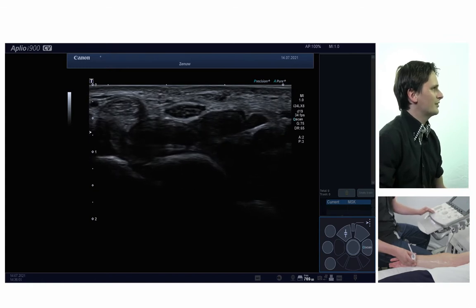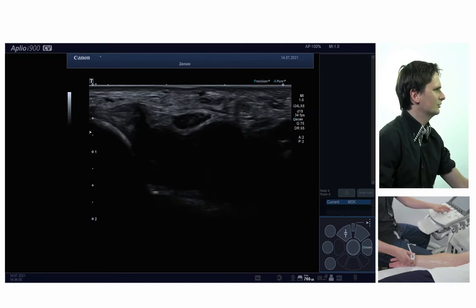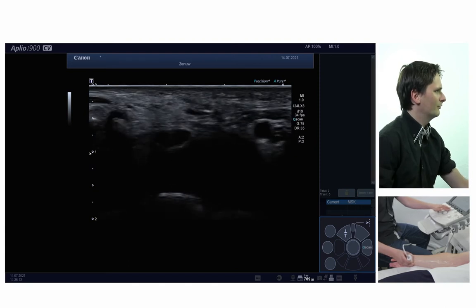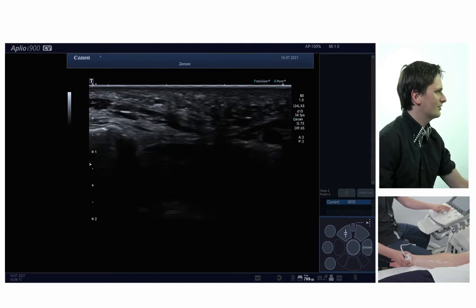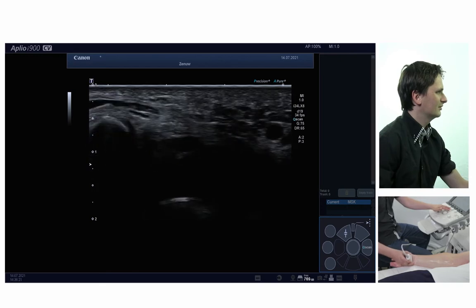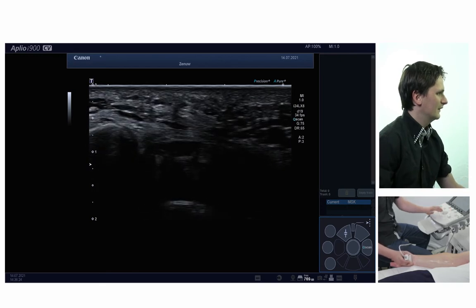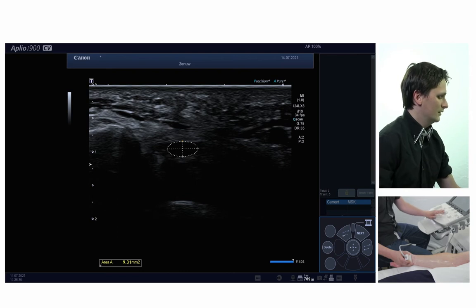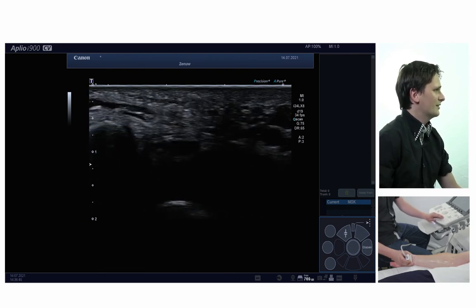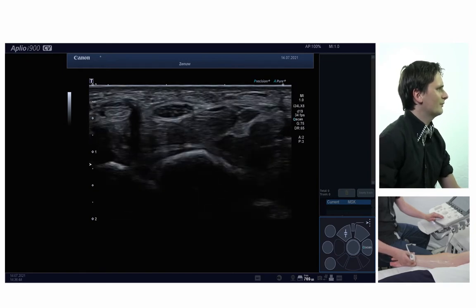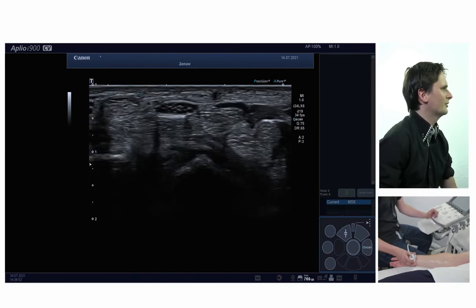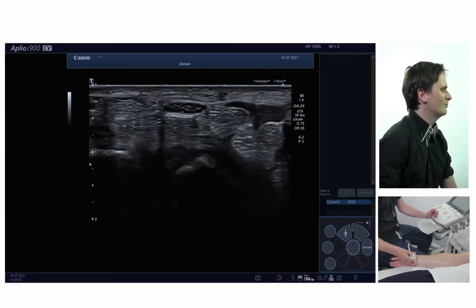Then I'll try to visualize the nerve more distally within the carpal tunnel. It can be a bit tricky sometimes because it will go deeper, so I will move my focus deeper as well and tilt my probe. Here you can see the nerve lying a bit deeper within the carpal tunnel — it's not enlarged here either. It's important to try to visualize the nerve more distally in the carpal tunnel as well, because otherwise you may miss a nerve enlargement and miss a carpal tunnel syndrome if you only perform the measurement at the proximal carpal tunnel.